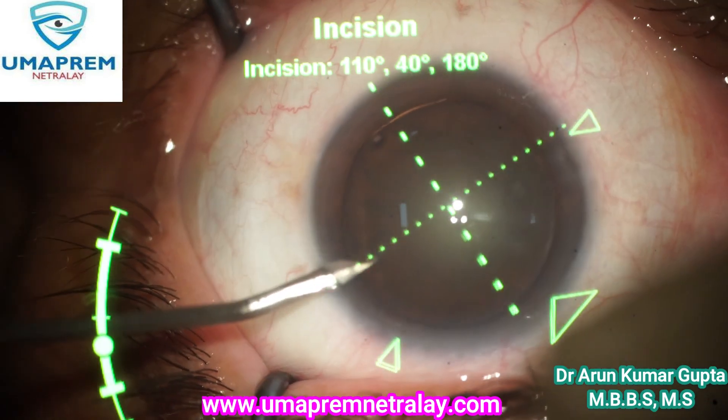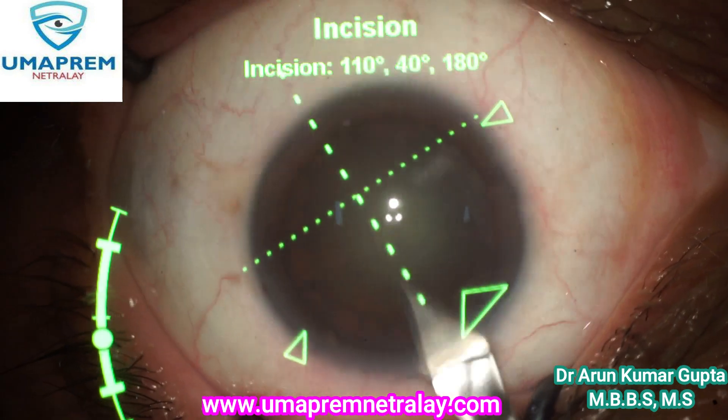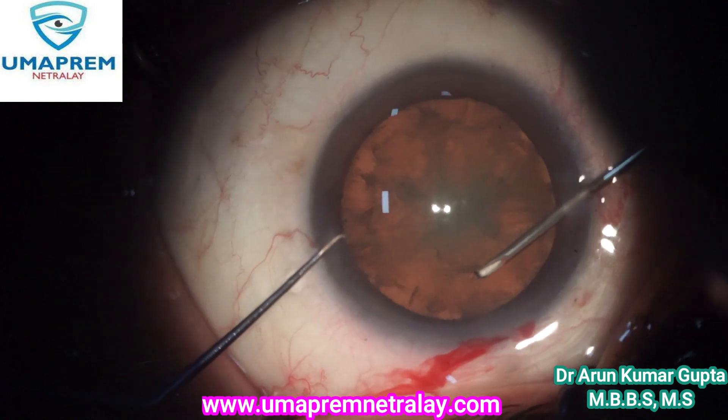Hello friends, myself Dr. Arun Kumar Gupta, Director, Umaprim Netrale. Today I am operating a case of cataract with our Argos variant planner. You can see here the Mendez ring.